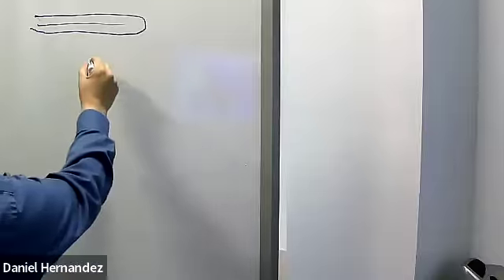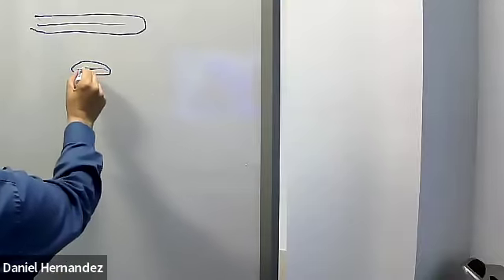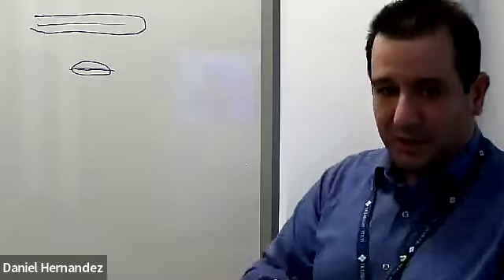I kept trying to turn on it and rotate it. No matter how I turned on it, it still looked like that. I still couldn't get it to get truly transverse. Every time I kept rotating, I was like, this makes no sense. I kept getting that same kind of almost longitudinal view. I was like, what is going on?